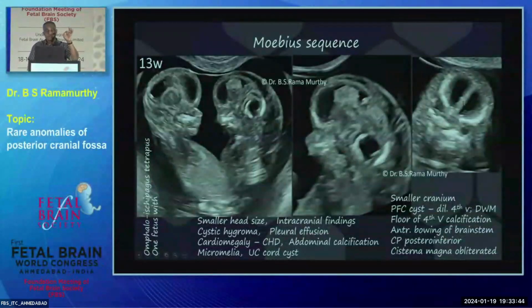This is interesting. Here is a 13-week case of conjoined twins. One twin is bigger and doing well. The other twin is smaller and had a host of problems. You can see micrognathia, cystic hygroma. You can see a smallish head, a receding look compared to this forehead.